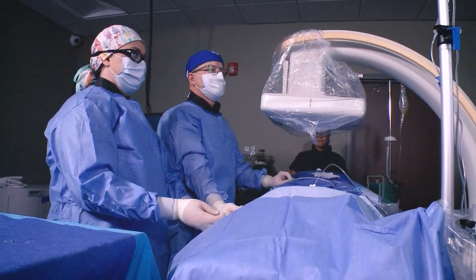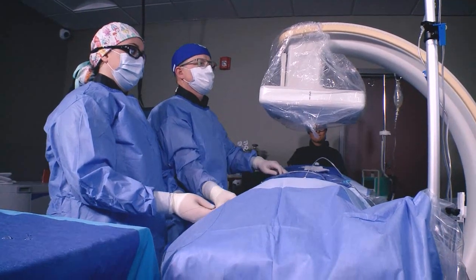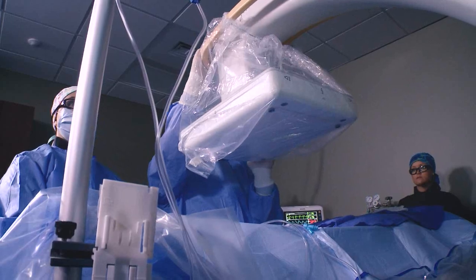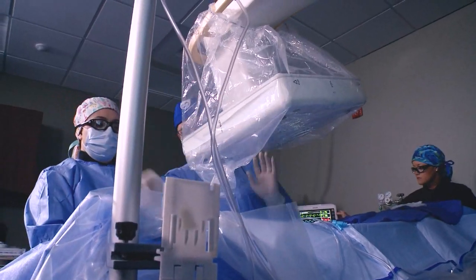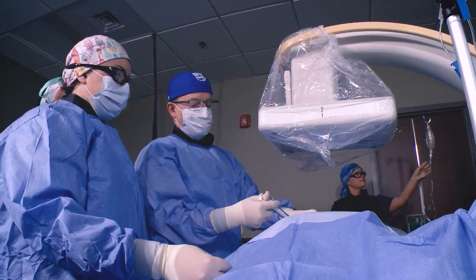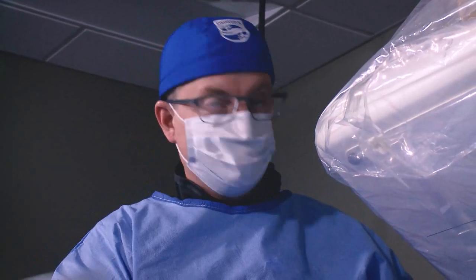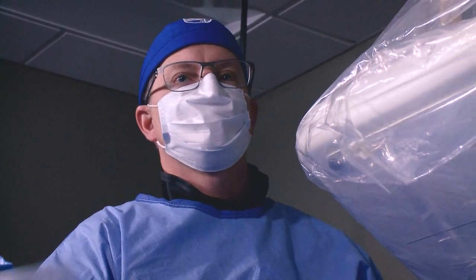In order to make an office-based lab work, you have to be efficient, and this unit has been remarkable in allowing us to do that. That starts from the small footprint allowing us to move the patient into the room, having the C-Arm out of the way in a confined space. And then it also starts with the patient input.